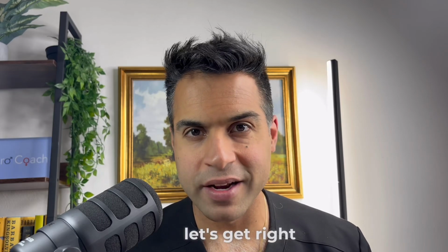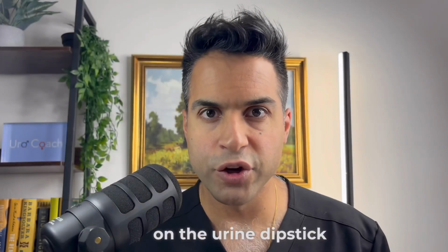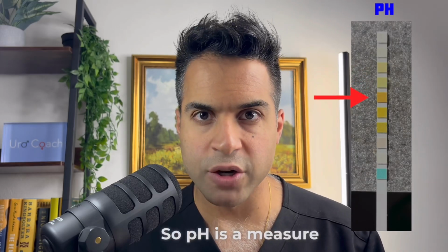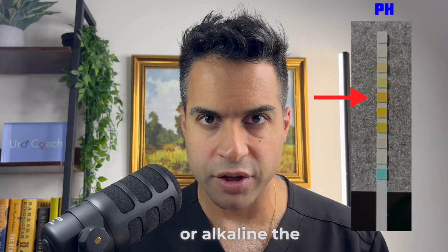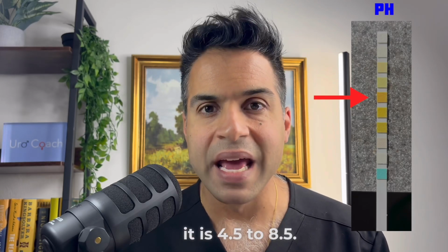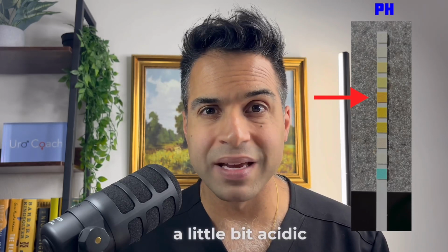All right, let's get right into it where we left off. So the next one on the urine dipstick on the diagram is urine pH. So pH is a measure of how acidic or alkaline the urine is. The range for it is 4.5 to 8.5, and typically urine is actually a little bit acidic.